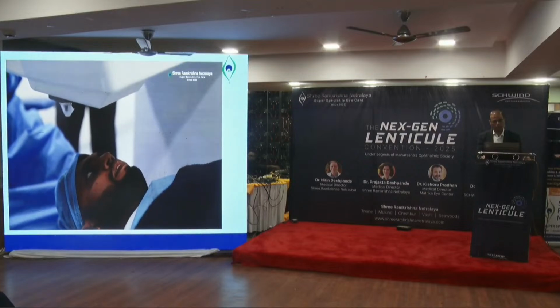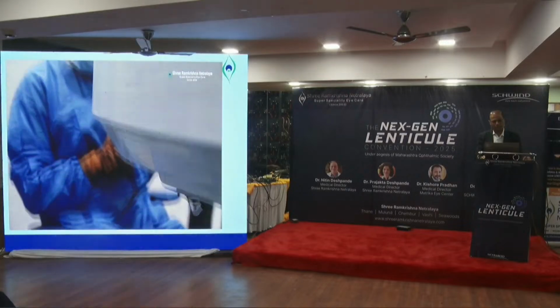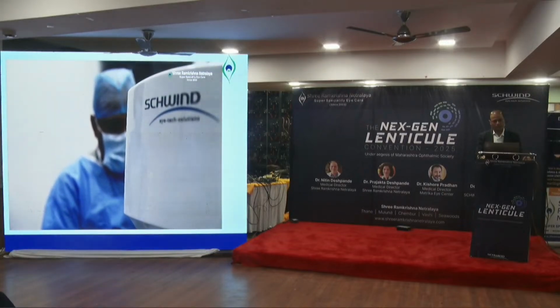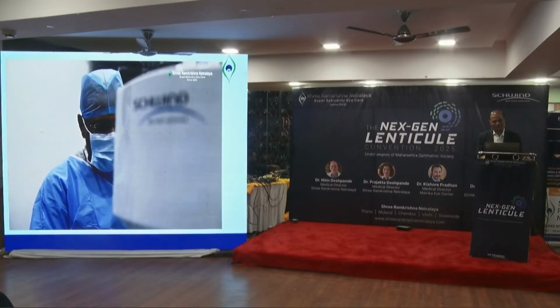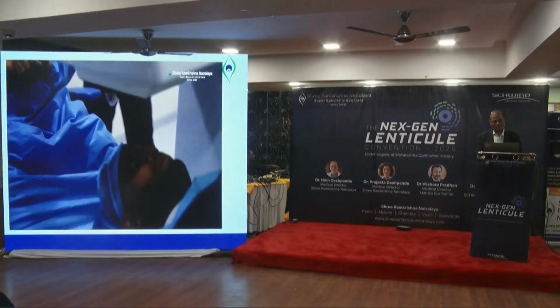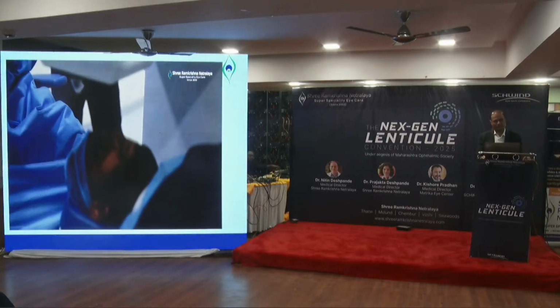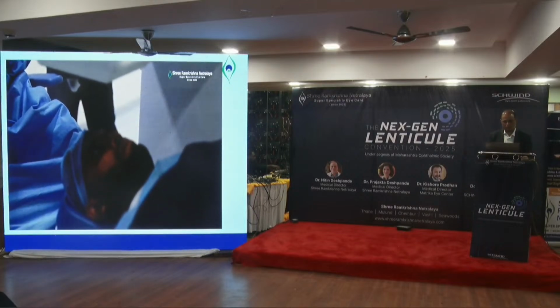So just keep seeing at the yellow light, and once this little cup will touch your eye, this yellow light will move away. But you don't have to worry about that. Just keep looking in the same direction, the direction you were seeing before. So you will feel little vibrations once laser is firing. But again, as I told you, it's painless. It just takes few seconds to finish that.